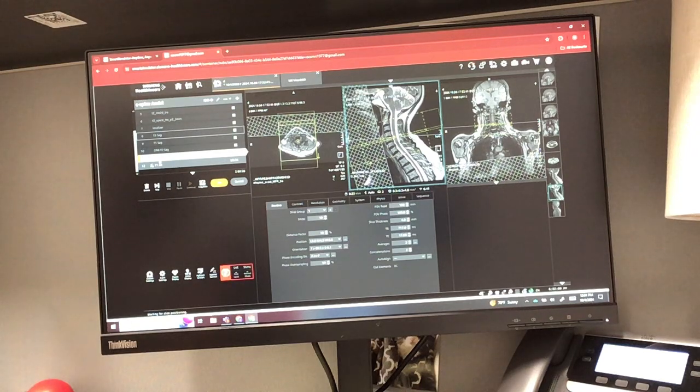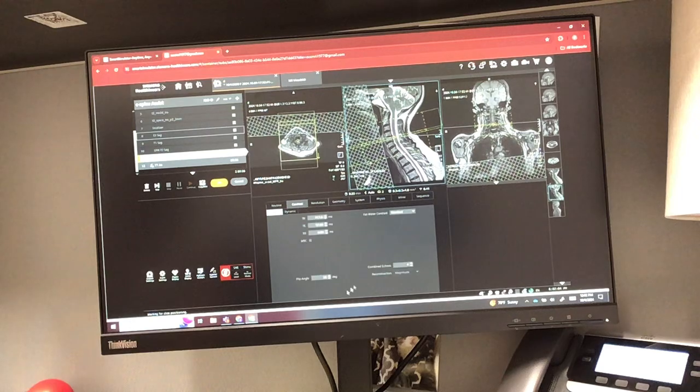It's a T2 star. This is a gradient echo pulse sequence. Okay. We're going to want a small flip angle. I'm going to change that to 20. Per your physics book, good parameters to start with is around a 400 TR and a TE between 15 to 20.